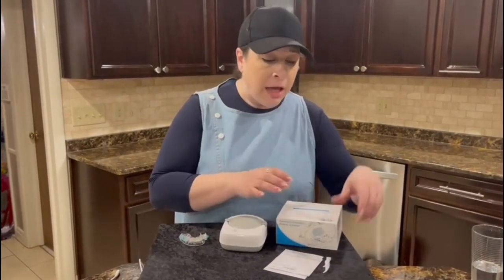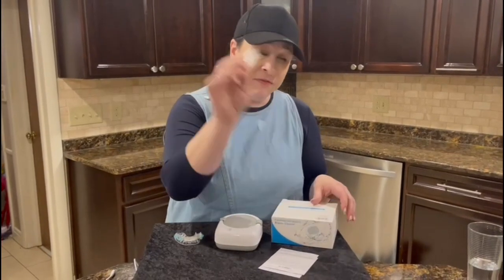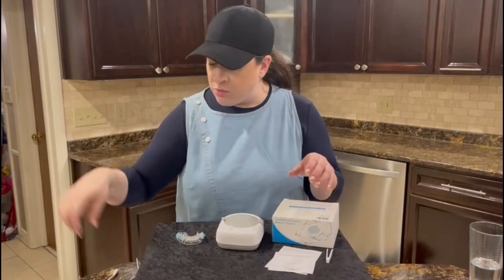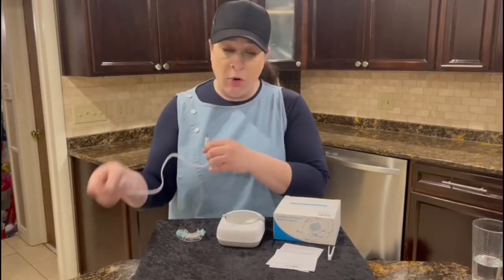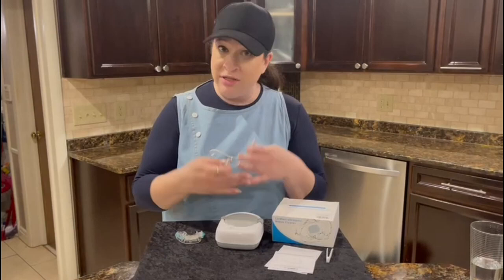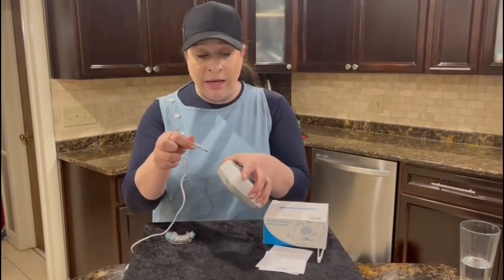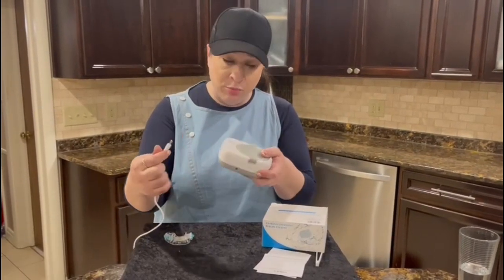It comes in this box. It comes with these tweezers, so if you want to use them to lift the item in and out, also a user's manual as well. And it's very easy to charge — it's a USB port. So not only is it cordless, but you could literally charge it anywhere you can plug in a USB port, and it plugs in right here. Super easy.